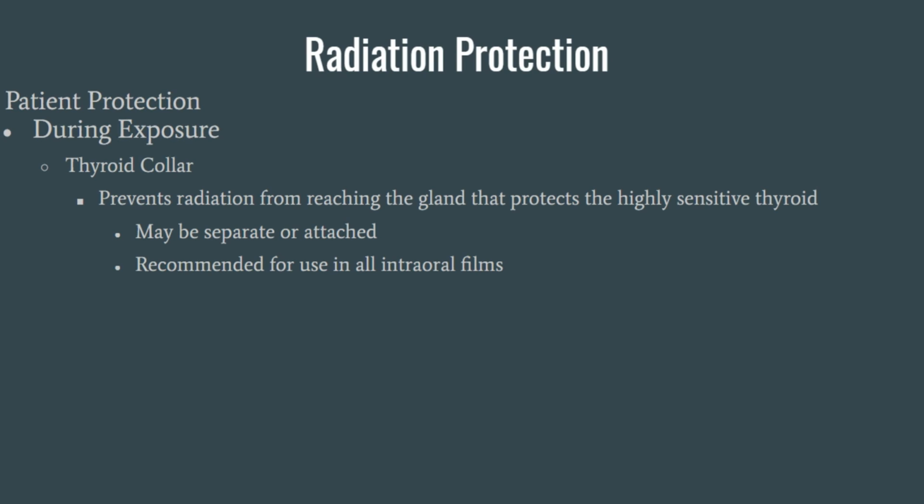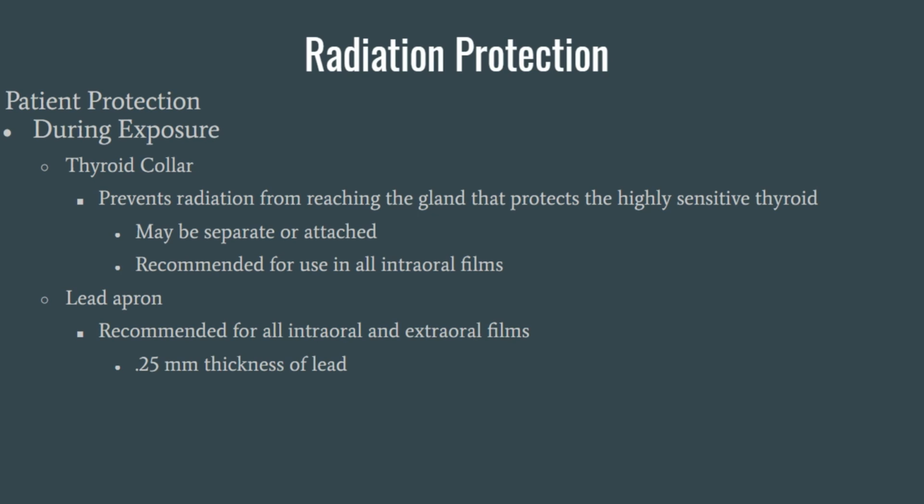And what it is recommended for is use in all intraoral films. Sometimes with those extraoral films, that thyroid collar could get in the way. So it's not typically recommended for extraoral films. And then the piece that the thyroid collar will be attached to, if it is attached, is the lead apron. This is recommended for all films. It doesn't matter if it's intraoral or extraoral. It is recommended for all films.